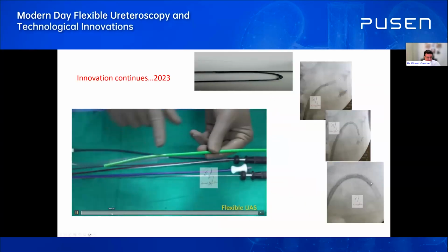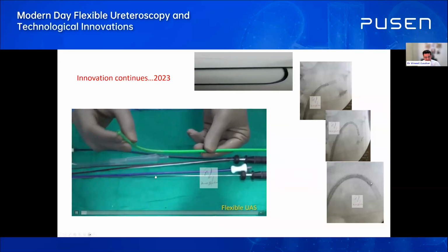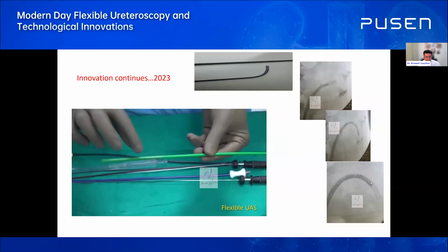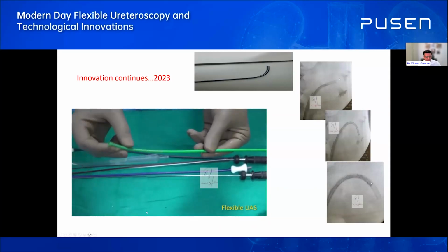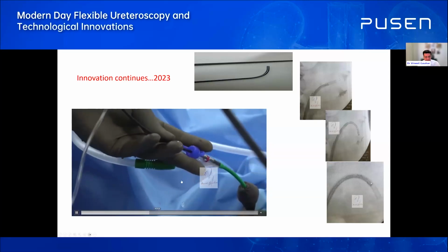I would probably run through this, but pay attention to this when you buy, whichever company. There are 6 companies now making it, and there are 3 more coming out. So that's how fast it's getting popular. Make sure that this is really, really flexible and bendable, because that is your key factor. If that can go into all parts of the calyx, you handle it just like you would do.